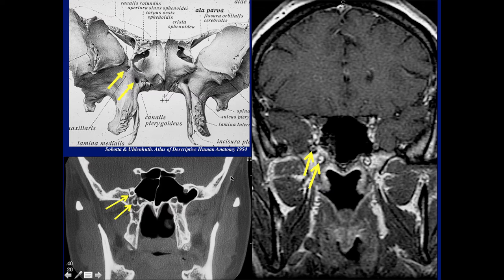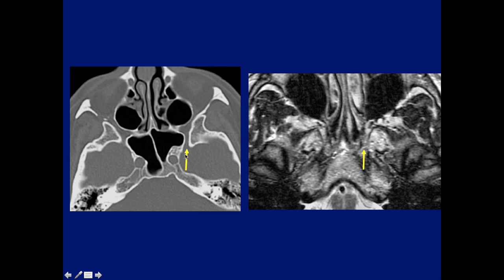On the coronal MR we can see the foramen rotundum with V2, the maxillary nerve sitting within it. This is post-contrast — normally you will see the rich vascular plexus around the nerve. Adjacent to it we can also see the vidian nerve in the vidian canal, which I'll discuss later. So again, foramen rotundum and vidian canal as we can see on the specimens here. Although it's easier to see the foramen rotundum on CT, on MR it's much more difficult, but we can see it again in this location.